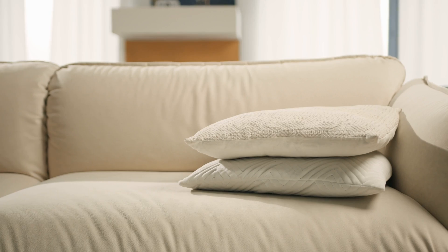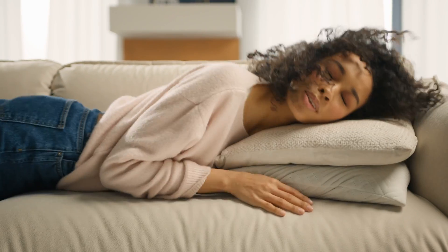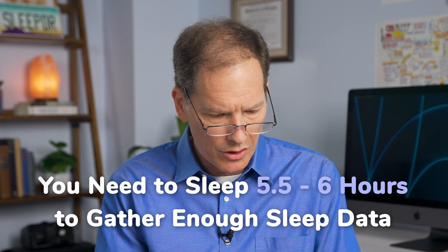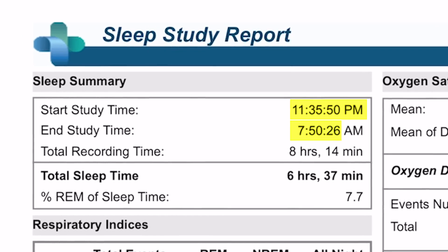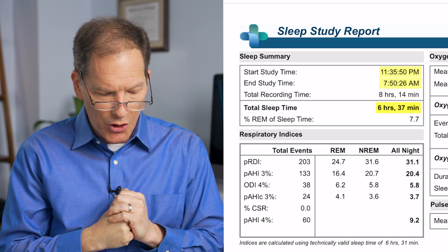The first thing I like to pay attention to is total sleep time. We're measuring from the time your eyes close and you actually fall asleep to when they open for the day. As a general guideline, we need enough data to make a diagnosis — that's going to run somewhere between five and a half and six hours. This patient went from 11:30 to 7:50 and got a total of six hours and 37 minutes, which gives us just enough data.